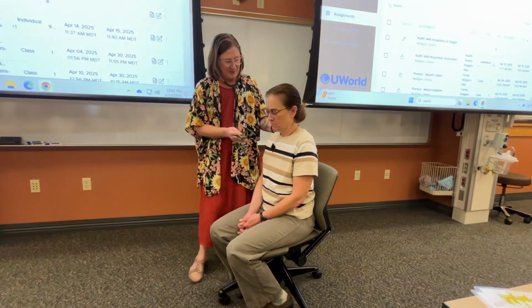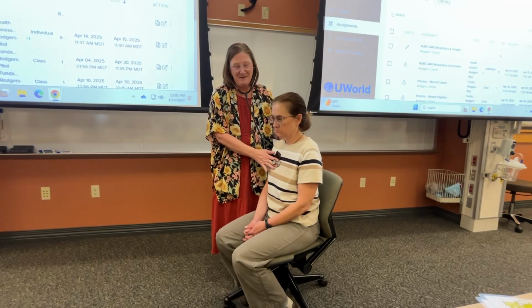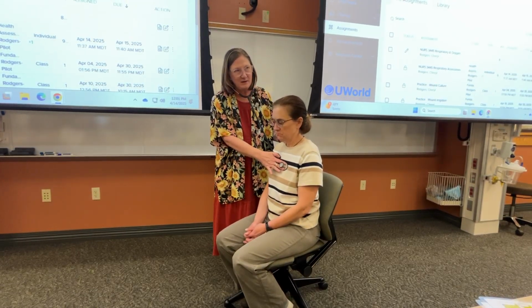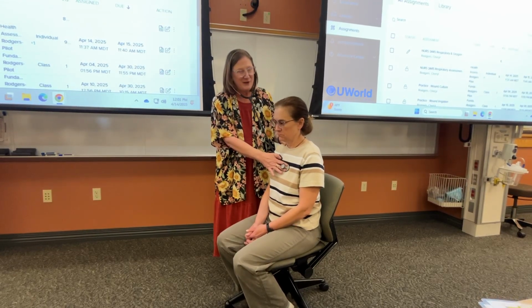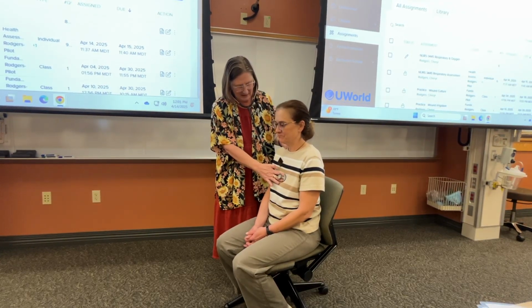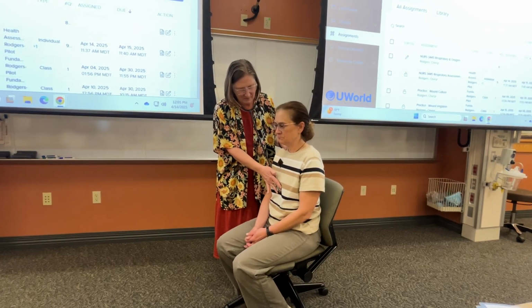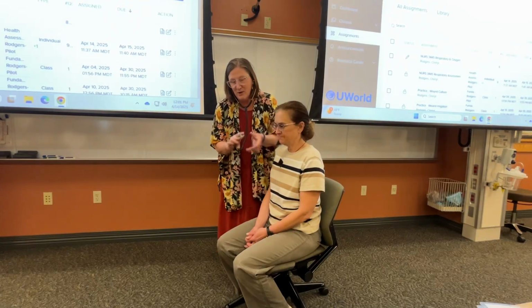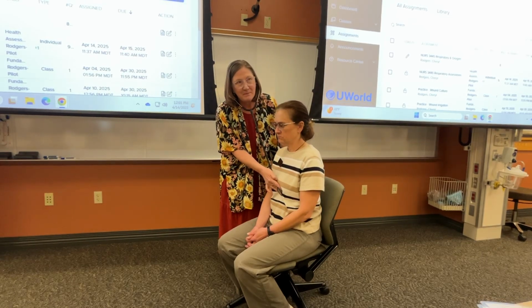Okay. Now, Mel, I'm going to listen to your heart so you can just breathe normal. So remember, I'm listening here. What am I listening for? Yep. And then we come across here. It's my mitral. You're my irregular heartbeat. And then we're going to come here. Now, since I'm here, remember, go ahead and flip it. We're going to listen on our way back up.